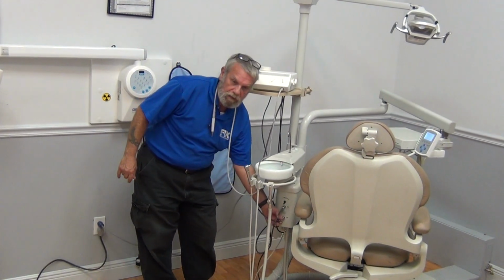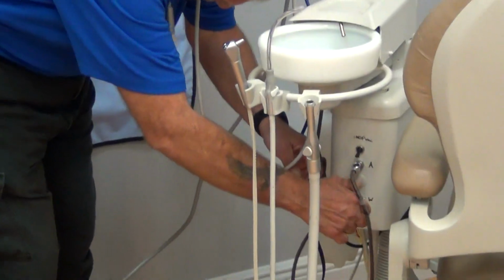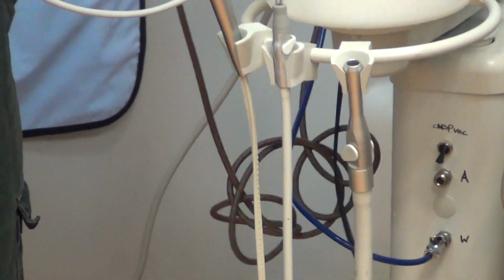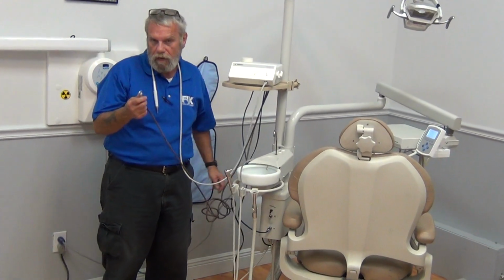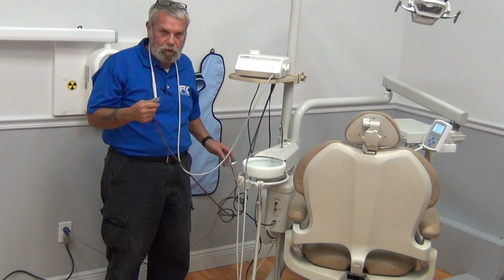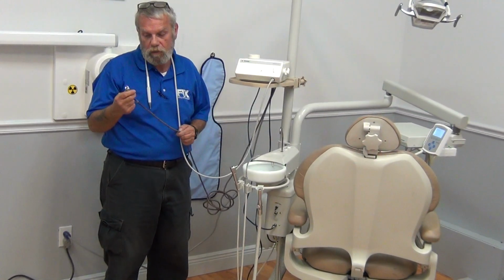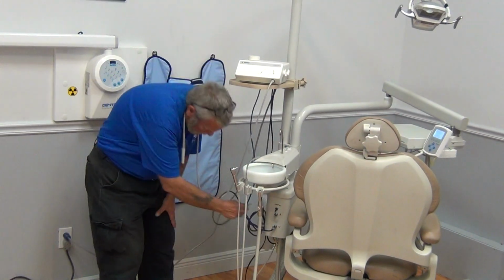Now, we got a complaint that we don't have any air. Sorry about the noise, guys. Repeat the water procedure. Trace your air source. Look in the console for the A logo. Match your quick disconnect to air. If it's plumbed in the J-box and run very professionally and nicely through the umbilical like it should be, you're going to have to get down in the J-box and make sure that the air is on and connected and you don't have any kinks in the tubing. We're going to reinsert the air tubing.